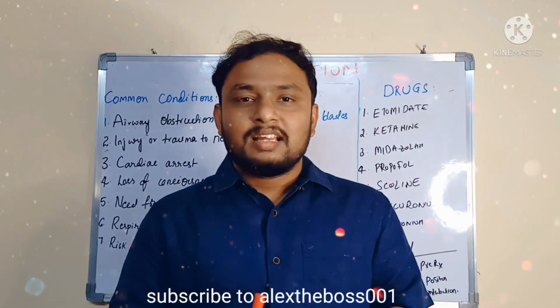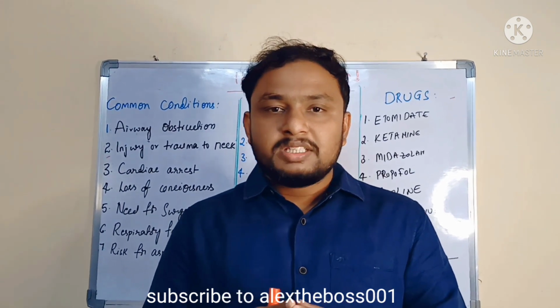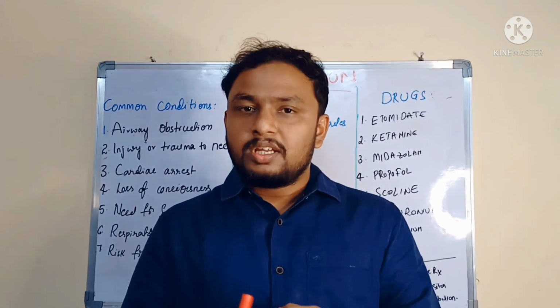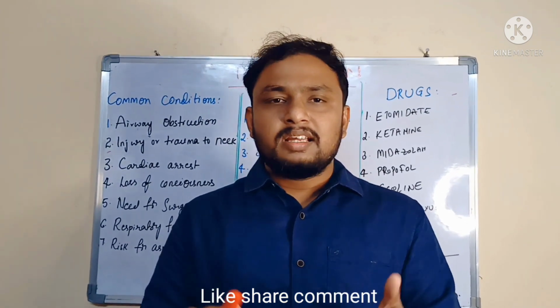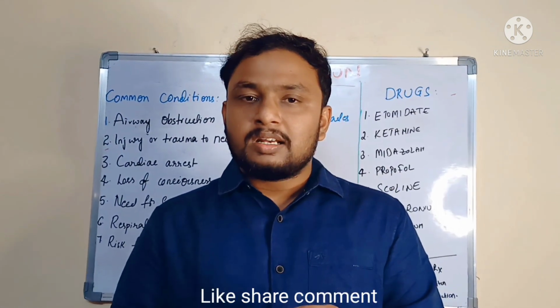This is Alex. In this video, I am going to teach you a topic: intubation, or endotracheal intubation. This topic is very useful for junior doctors and nurses who are working in ICUs and emergency areas. What is intubation? Intubation is an emergency procedure.